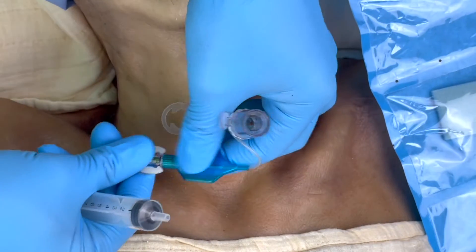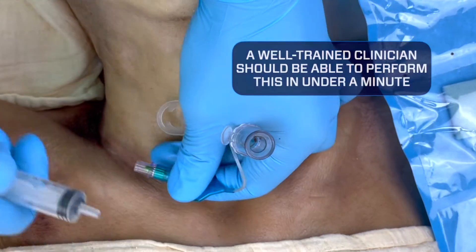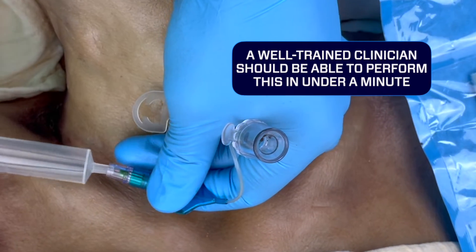Once the tube is in place, remove the bougie. Go ahead and inflate the cuff, and you've completed your cricothyrotomy procedure. This should take less than 45 seconds.